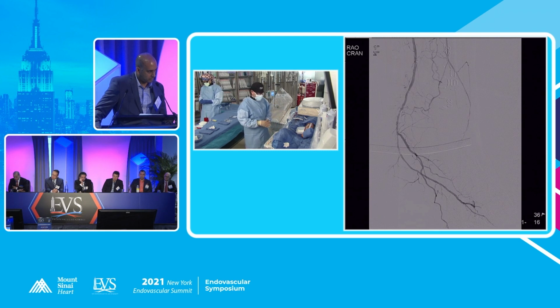Let me get opinions from the panel. Should I do anything else? Would anybody put a drug-eluting scaffold distally in the posterior tibial artery, or an interwoven scaffold in the common femoral artery, or go to a 9.0 DCB in the common femoral artery, or would we declare it a victory on not my own lab, and playing an away game?